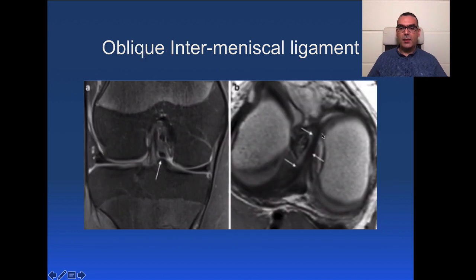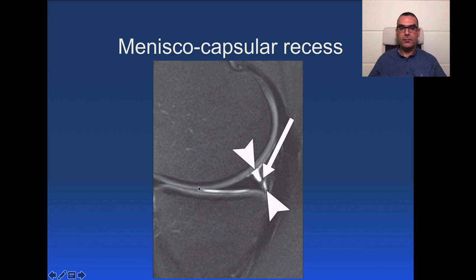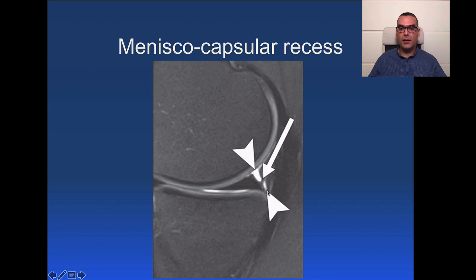The oblique intermeniscal ligament is also a common variant that can be mistaken for a meniscal tear or a loose intraarticular fragment. The meniscal capsular recess is the fluid-filled space between the meniscus and the capsular attachment, confined by the meniscal capsular ligaments. Once you see the meniscal capsular ligament passing through with a clear-cut, well-defined linear base of the meniscus, you should not mistake this for a meniscal capsular separation or a peripheral meniscal tear.